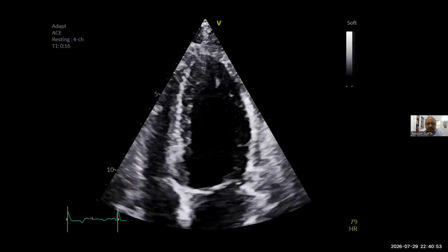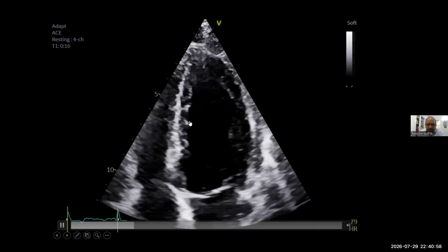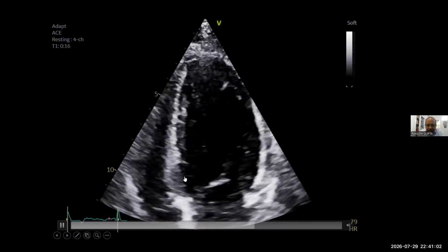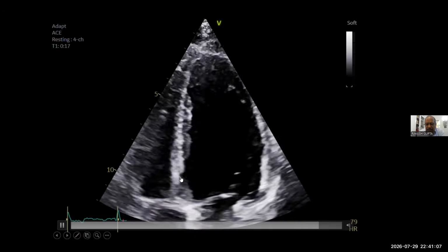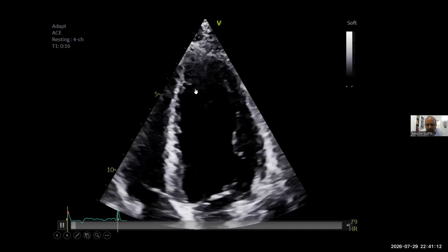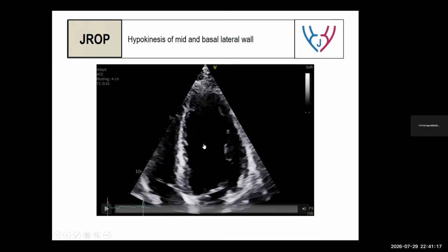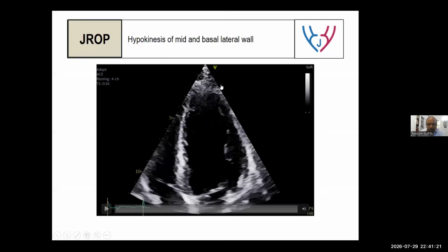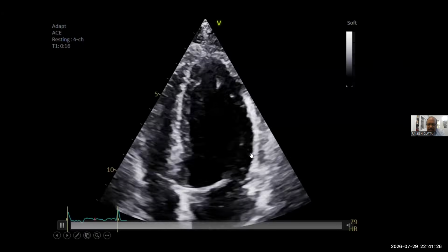Now concentrate. Yes, sir. You are concentrating on this myocardium. I'm concentrating on this endocardium. Right. So this is thickening. All of this endocardium is thickening, except for some speckle of endocardium, which is not seen in basal septum. Rest, look at this, mid thickening, apical thickening. Apex is thickening. Okay. Then apical anterior wall is thickening. There could be some hypokinesis in the lateral wall.